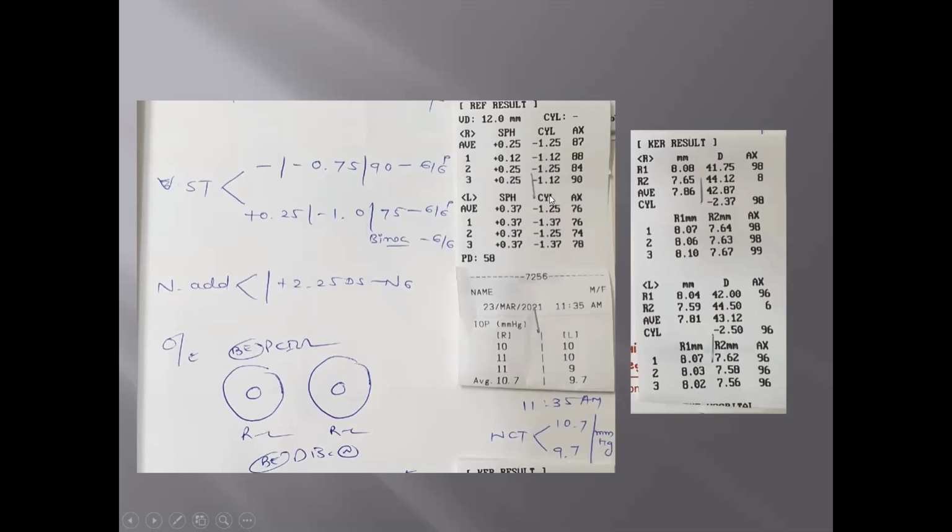This will give the benefit of good near vision, and though the unaided visual acuity is not mentioned here, the binocular unaided visual acuity is 6/9 for distance and near almost N8, and with that almost all work can be done without glasses by the patient. Yes, on addition of glasses, the clarity improves much more.